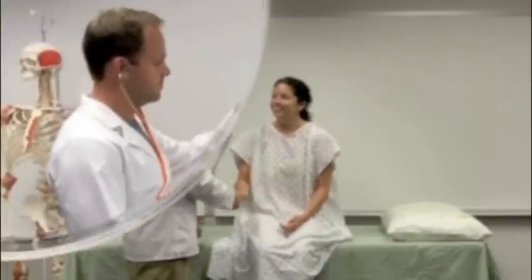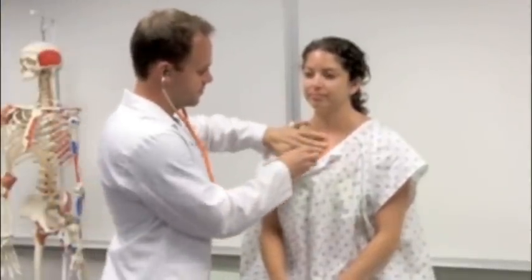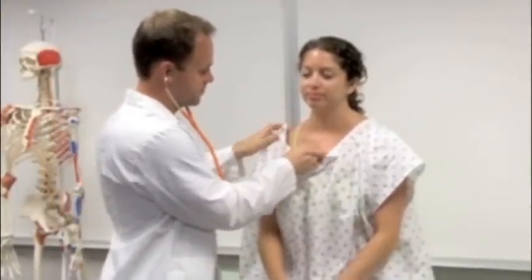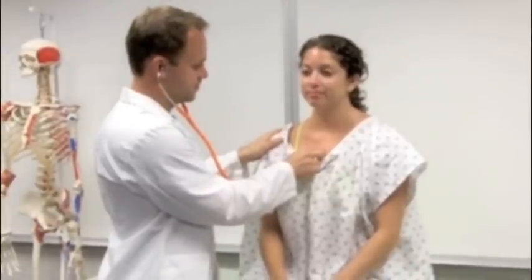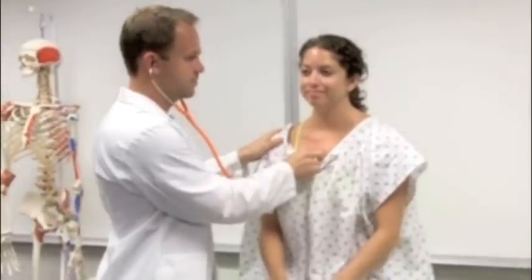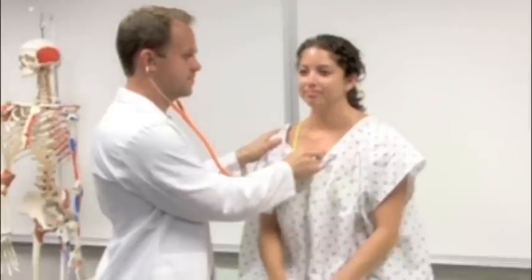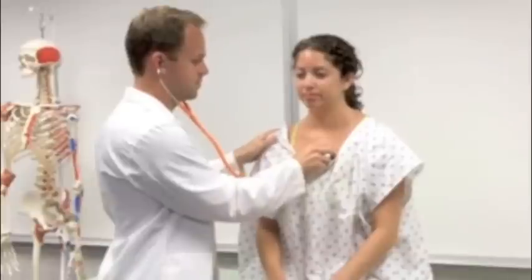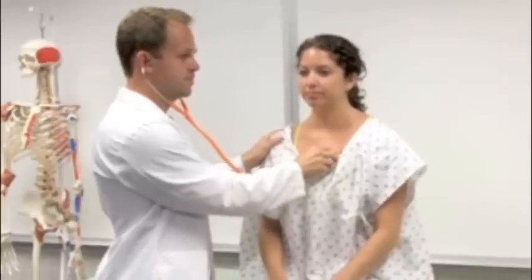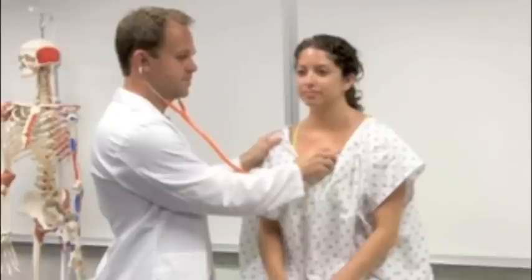Performing heart auscultation on the female patient requires more precaution, especially by the male clinician. Draping becomes more of a concern throughout the examination. Note, the clinician is looking away during auscultation to avoid inappropriate eye contact with the breast. The valves are assessed in the same sequence.